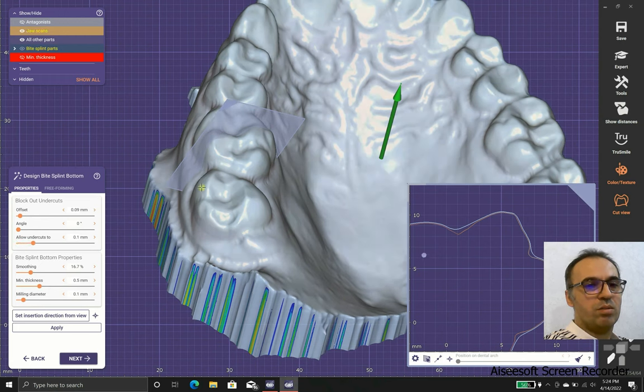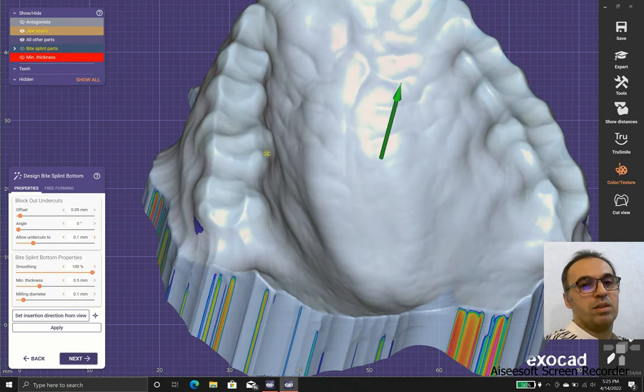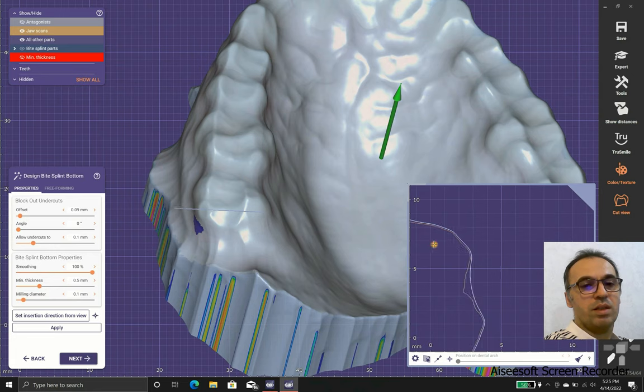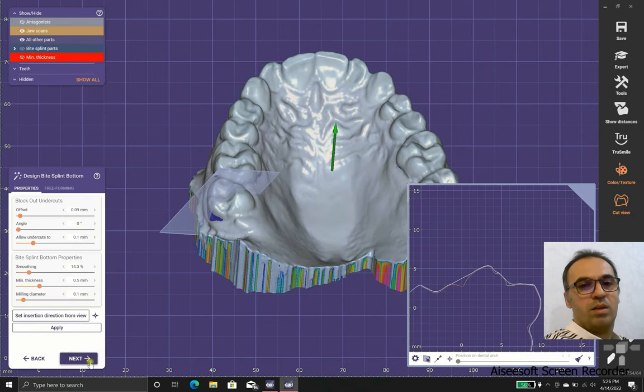The next thing we should talk about is smoothing and minimum thickness. A minimum thickness of 0.5 is good, as there are lots of resins that need at least 0.5 millimeters. Smoothing means how much the software allows the use of undercuts, grooves, and pits. As you can see, using 100% smoothing means we are not allowing indentations or cusps and fossae. We use the presets for the beginning, and after a while we can adjust as needed.